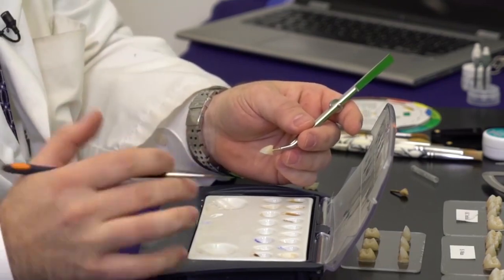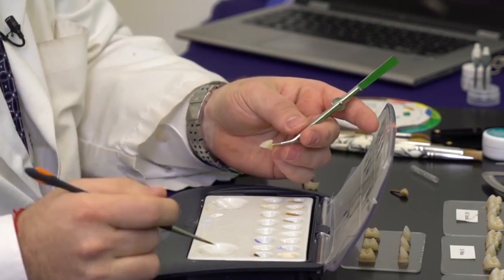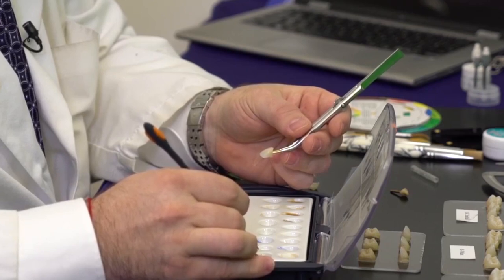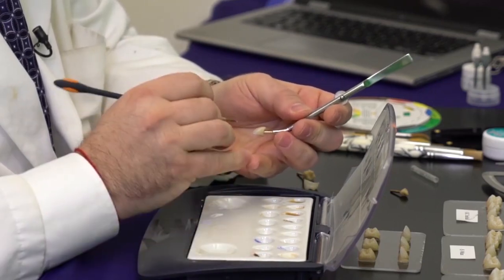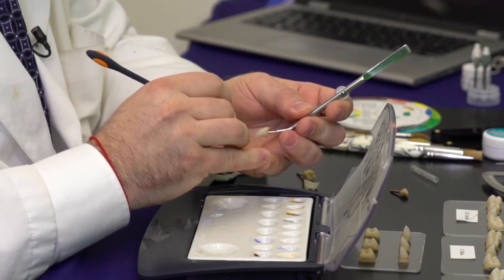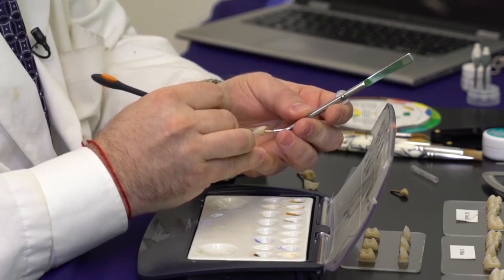Once I've placed the blue — achieving not only the incisal but also the distal up to the middle third as well as the mesial perhaps a little shorter — I can also layer a little bit on the lingual to really give it that effect. On a lighter shade I use a contrasting of blue and white, whereas on a darker shade I use contrasting of gray and white — that's more a control of value. Then I take a little bit of white stain and very faintly cut in different angles.